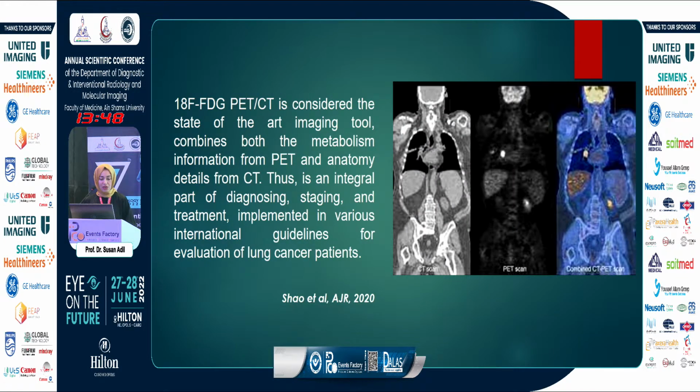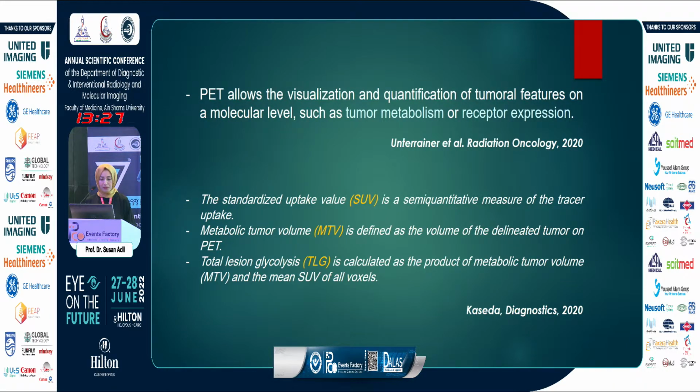FDG PET-CT is considered the state-of-the-art imaging tool that combines both the anatomic information from the CT images and the metabolic information from the PET images, and this is an integral part in diagnosis, staging, and treatment, and implemented in various international guidelines for evaluation of lung cancer patients.